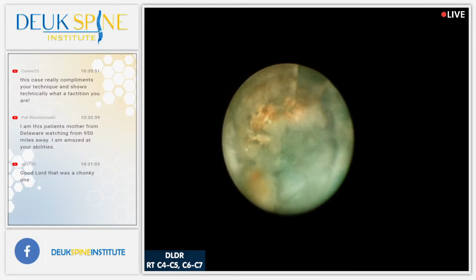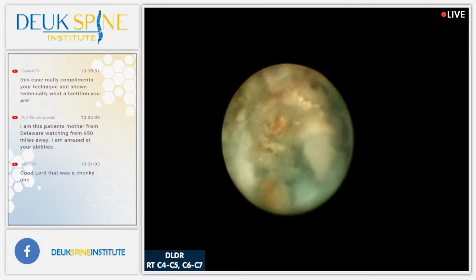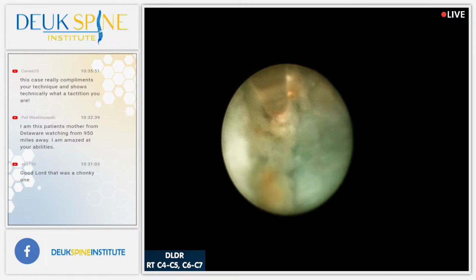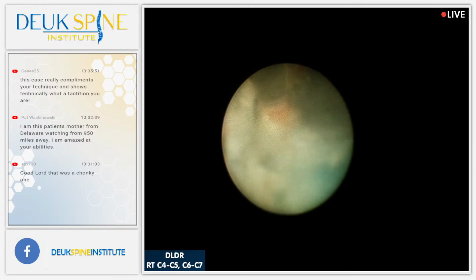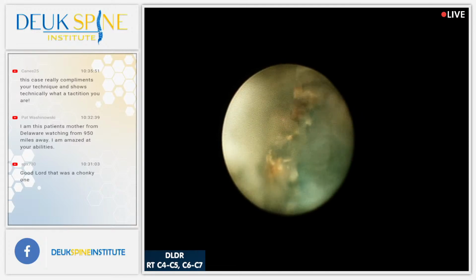When you talk about an ACDF, oh, look at the herniation just pop out. You guys see that? How cool is that? Oh, I love it. Success. That's it, man. We are just about done with this disc. I'm going to go look at the other side one more time. But we just decompressed the nerve root. It's incredible.